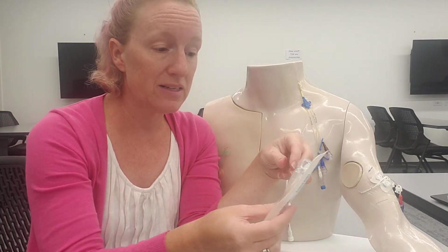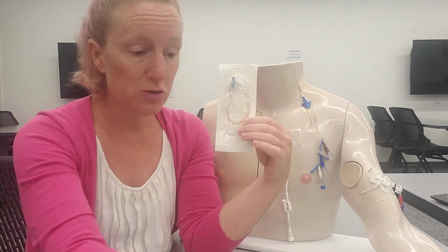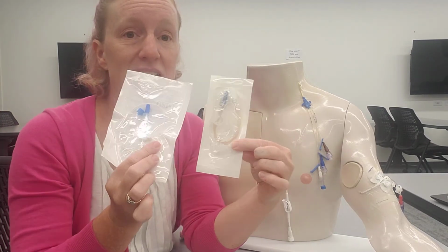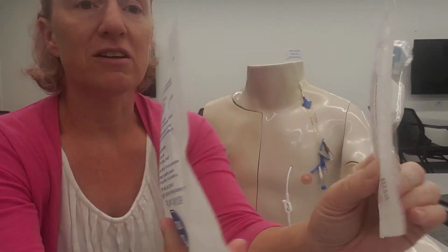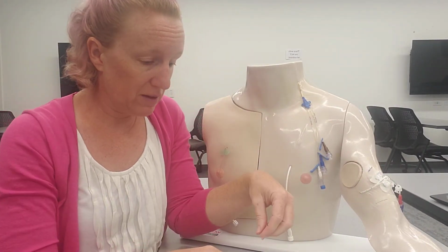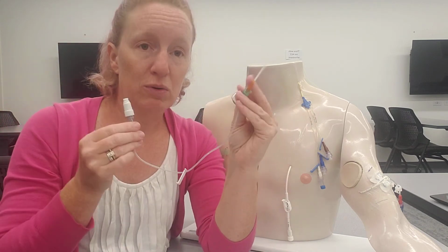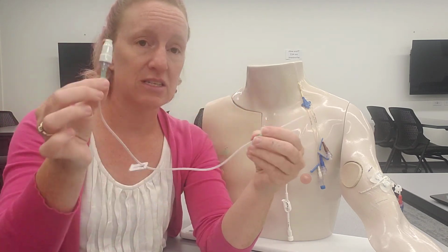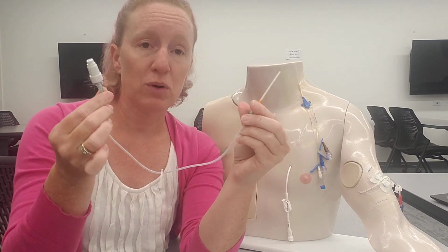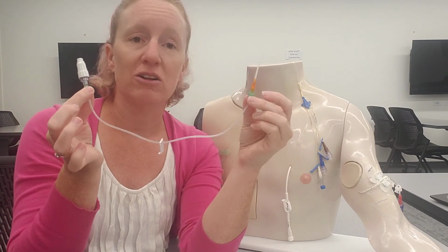Next thing you're going to want is some sort of extension tubing. I call it a pigtail. So you'll often hear me say pigtail. See, again, same kind of thing, but a little different packaging. You'll get used to the supplies in your facility. So like I have here, I have a peripheral line hooked up with extension tubing to an adapter or a clave. And it's really important that we have all of this, because that is now called a saline lock.